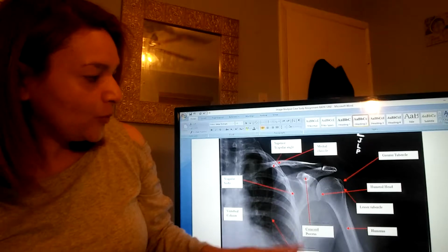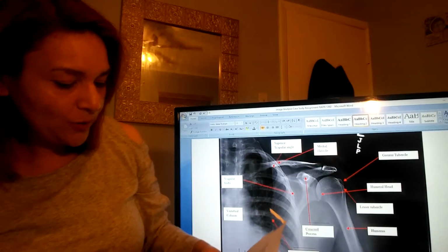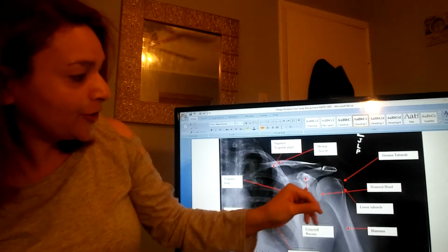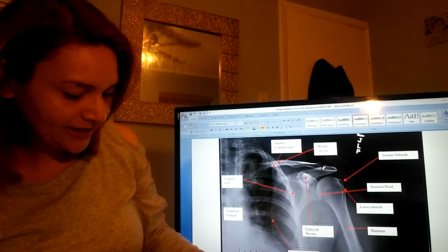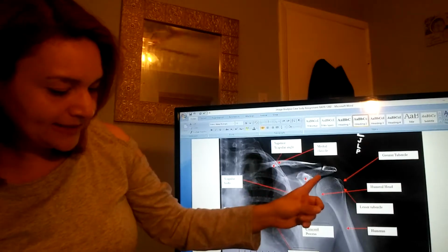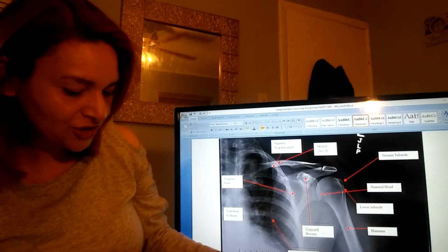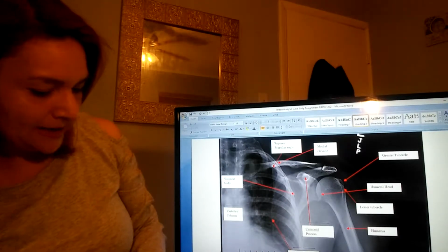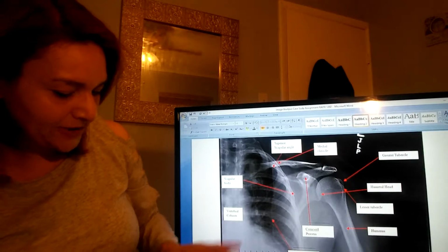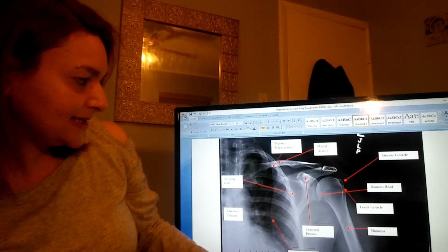What you need to ensure is in your image here is that your glenohumeral joint is here, which we have. Our clavicle is in the picture, which is here. You want to make sure the proximal humerus is also in your picture, and your superior scapula is also included in the exposure field, which everything is here.